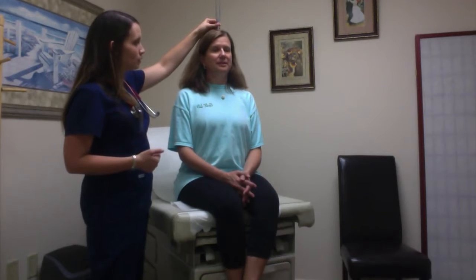So, next I'm going to do the Weber test. The next two tests, I'm going to use this tuning fork. So for this test, it's a Weber lateralization test. I'll place my vibrating tuning fork in the middle of your head and ask you if you can hear the sound equally on both sides. Okay. Sounds equal. Equal on both sides. Okay, that's good. If it were heard more on one side or the other, that could be indicative of conductive or sensory neural hearing loss.